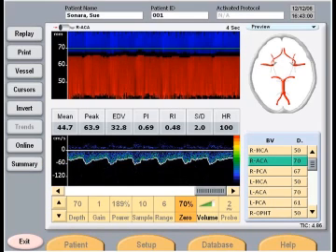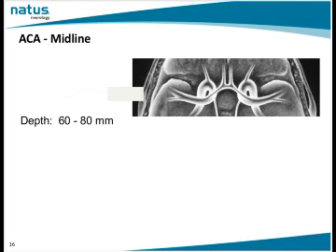It's there, but very, very faint. And our M mode shows that we're in the blue, which is flow away from the transducer. So we took a picture at the bifurcation. We want to go a little deeper and take a picture of the ACA, which we have here. And then we can trace all the way into midline.